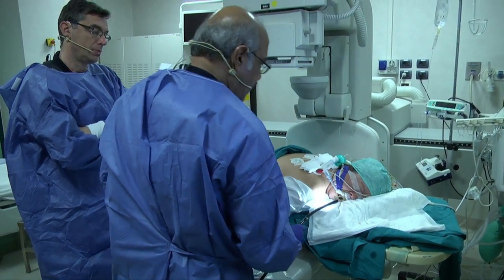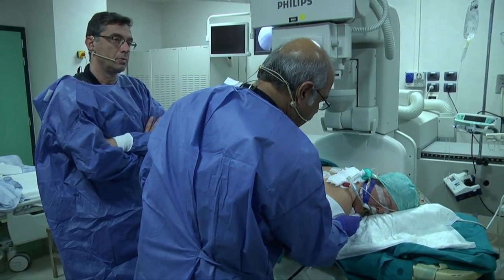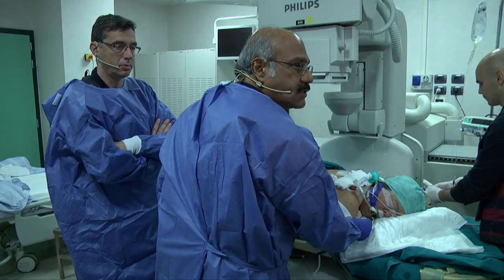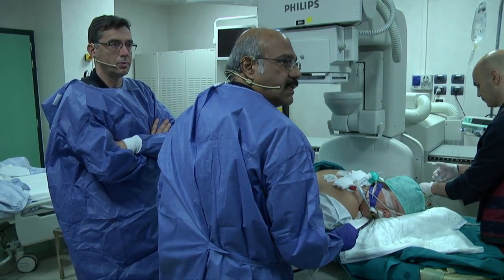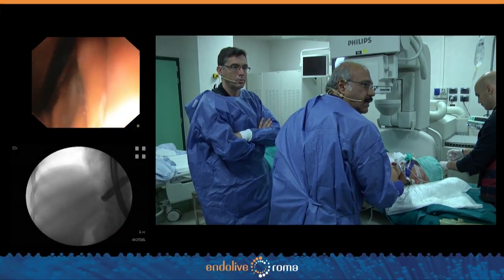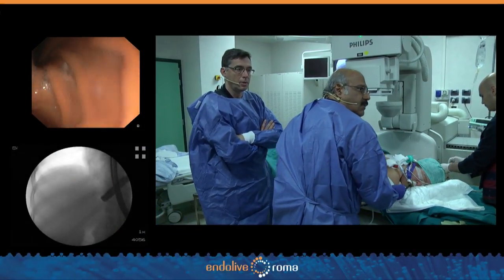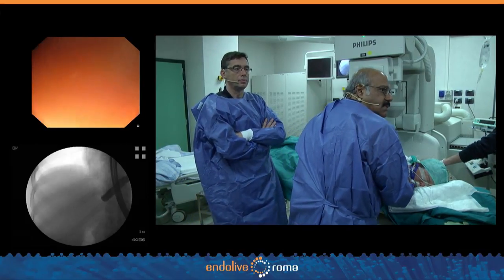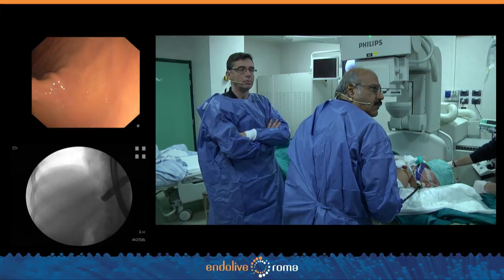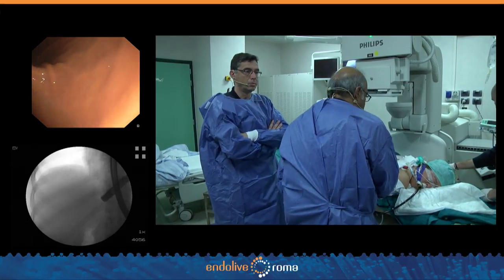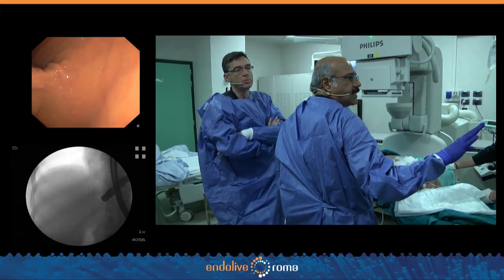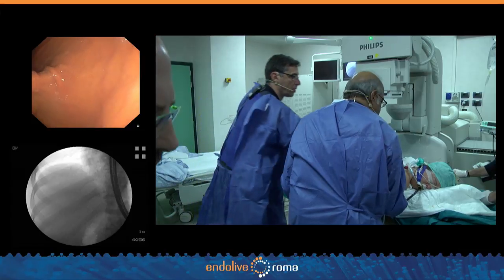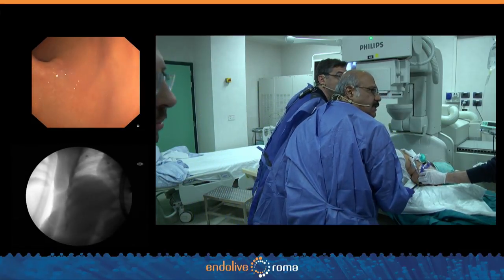We're going to go down into the duodenum and have a look at the lesion before deciding what to do. The procedure is ampullectomy, but we need to study the exact location of the papilla — that's very important. The patient is in a prone position, though when totally prone, getting up to the pylorus can be difficult, so we turn the patient a little left lateral to make intubation much easier.